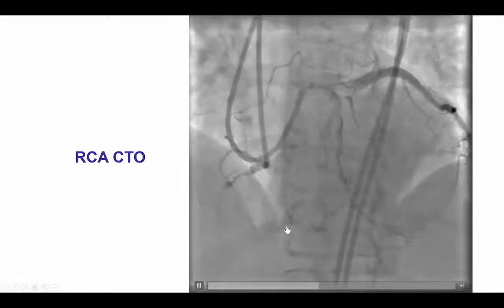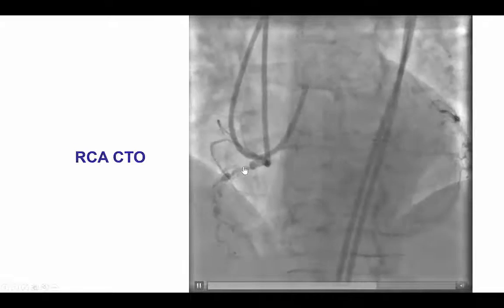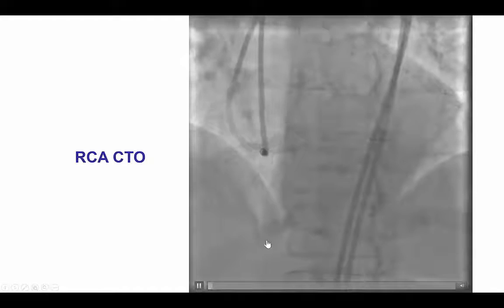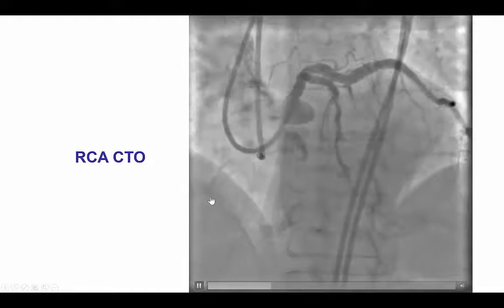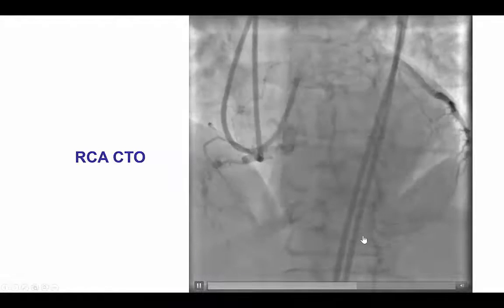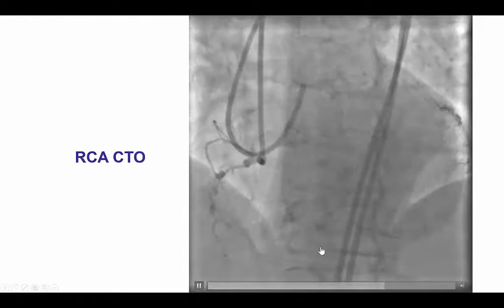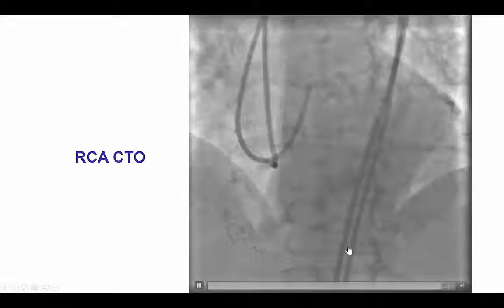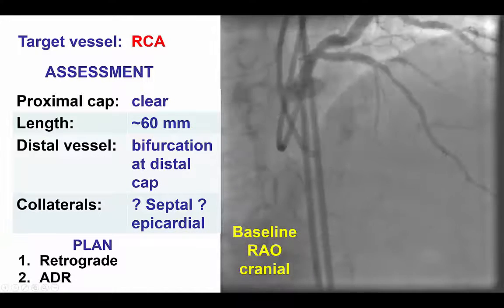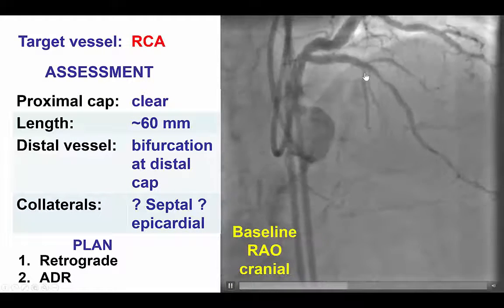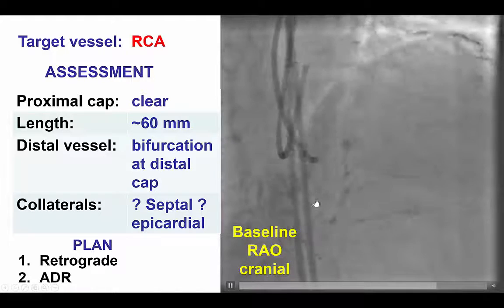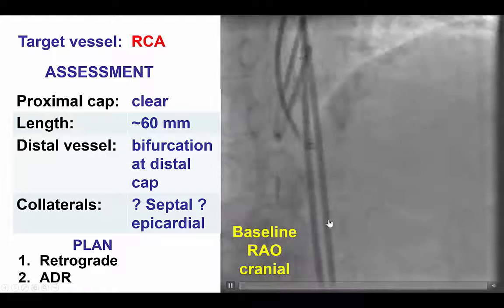The entire RCA was heavily calcified, with the outline of the vessel being visible even before contrast injection. The occlusion was at the mid-segment of the right coronary artery, with the PDA reconstituting via collaterals from the septal as well as epicardial collaterals. There appeared to be potentially some septal collaterals, some epicardial collaterals, and the distal vessel was diffusely diseased.